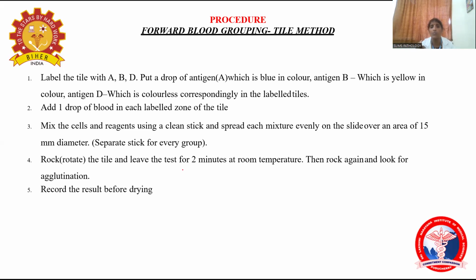Another point to be noted is that when you mix each mixture, you have to use a separate stick. You have to use an individual stick for each column. Remember that, because if you use the same stick in the other column, you are carrying the A antigen into the next. So it will be falsely interpreted.